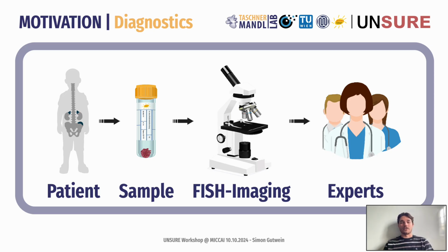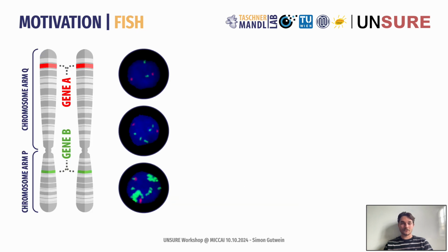So the term fishing in the title is a play on words on the term FISH, which stands for fluorescent in situ hybridization, which is a crucial method in cancer diagnostics. FISH helps us to identify clinically relevant subtypes in cancers such as breast cancer and neuroblastoma.